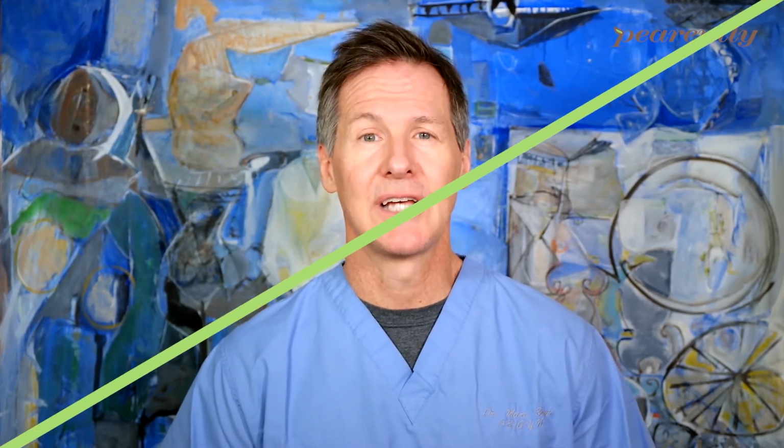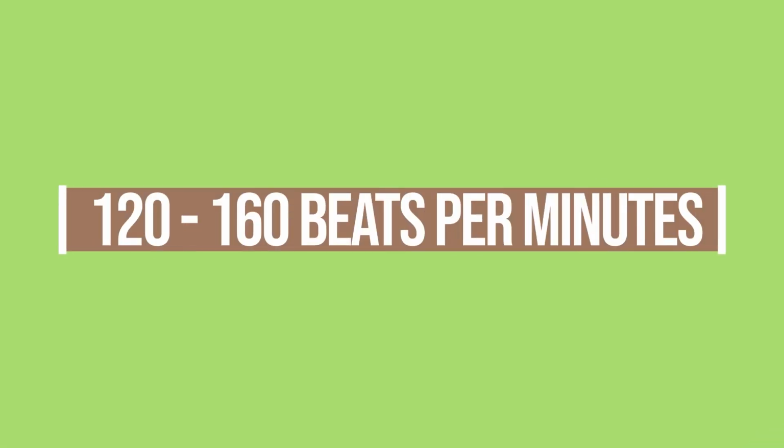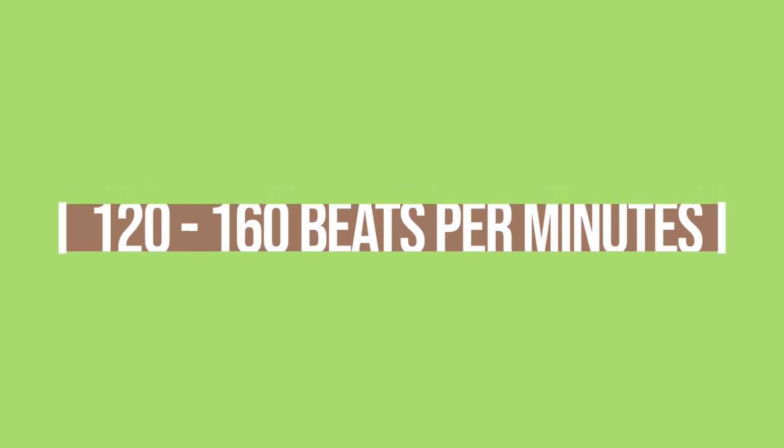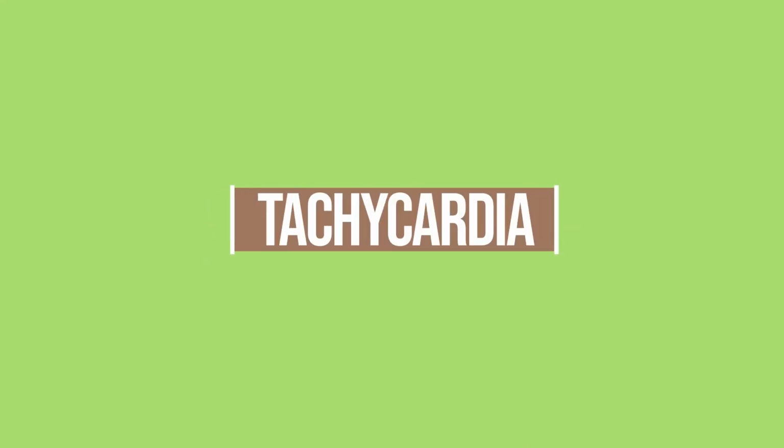The first thing it looks at is the fetal heart rate baseline. The baseline means it's an average of what the heart rate is doing up and down and gives you a baseline average. This average should be between 120 and 160. If the baseline falls below 120, it's called bradycardia. If it's above 160, it's called tachycardia. So we want this baseline to be in that range of 120 to 160.